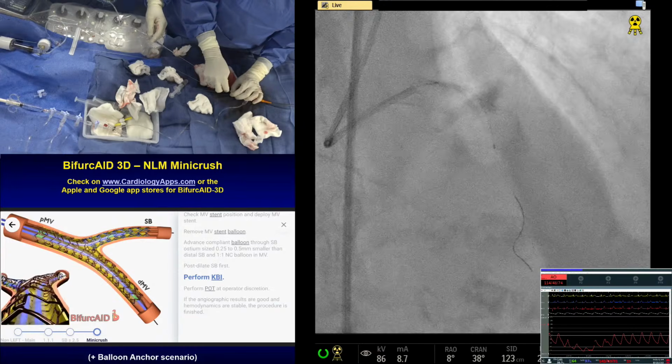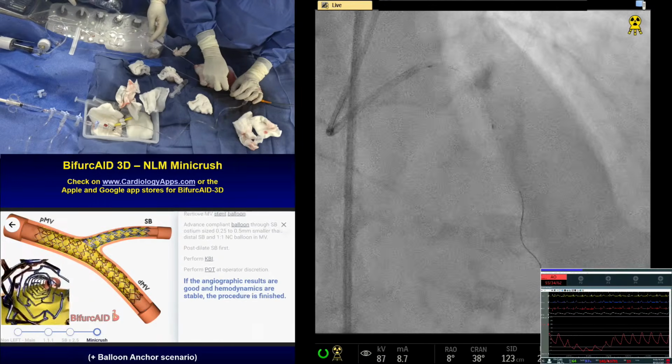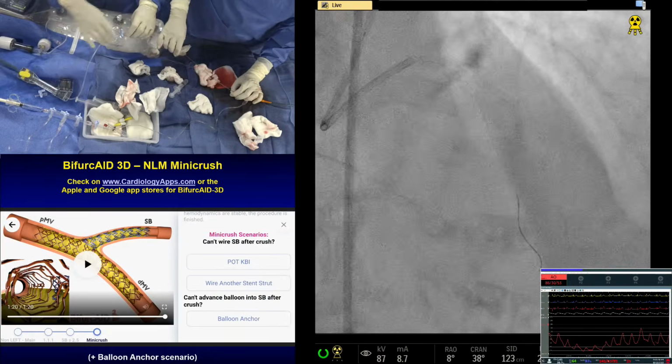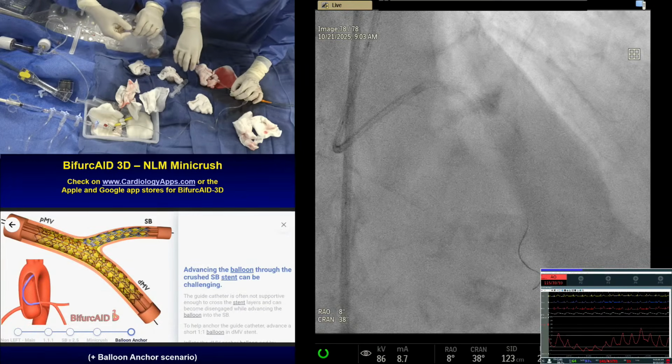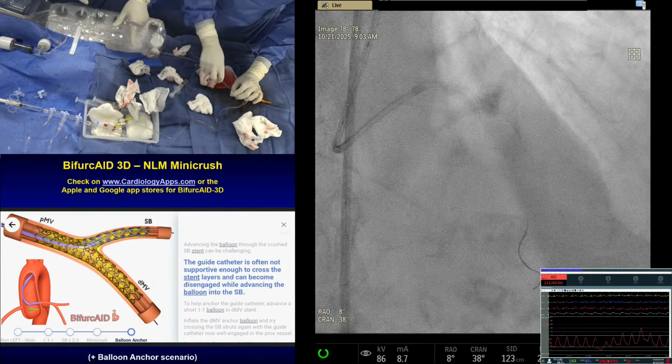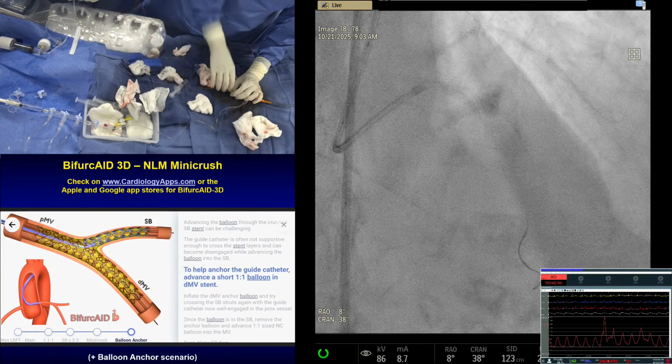Actually, there was a study one time that showed that 60-second inflation gives you better MSA, because it takes that long for the dye to reach there. Good. Take everything this out. No, we needed the wire. Probably it's gone now. Yeah. Get us a new Fielder wire.